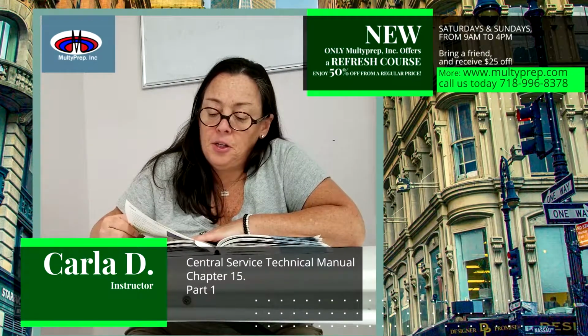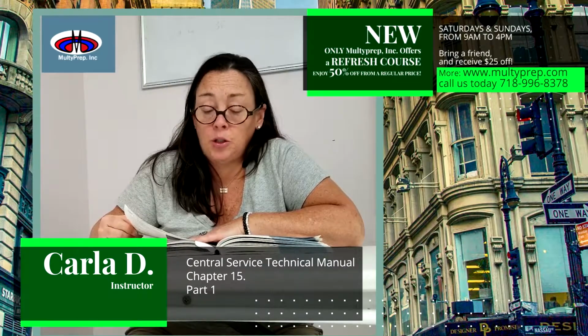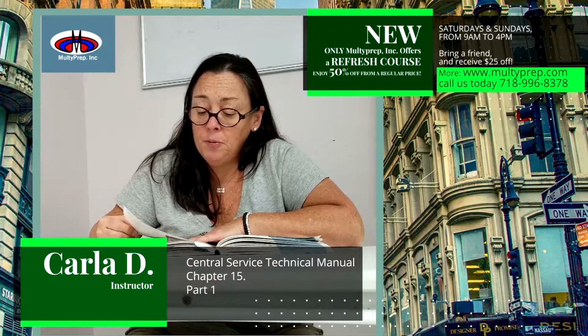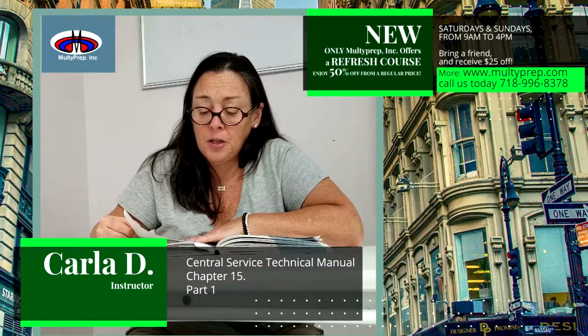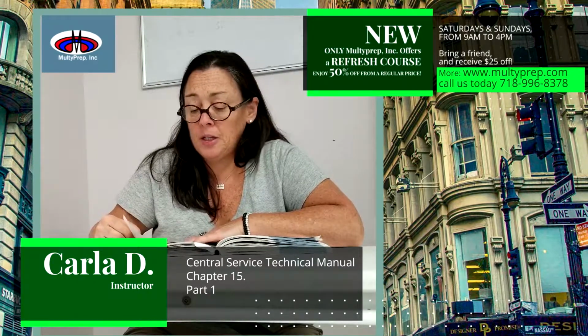The basic ETO sterilization cycle consists of 5 stages: preconditioning and humidification, gas introduction, exposure, evacuation, and air washes. The cycle takes approximately 2.5 hours, excluding aeration time. Upon completion of the sterilization cycle, the items must go through an aeration process to remove all residual ETO before the sterilizing chamber can be unlocked and the items removed.